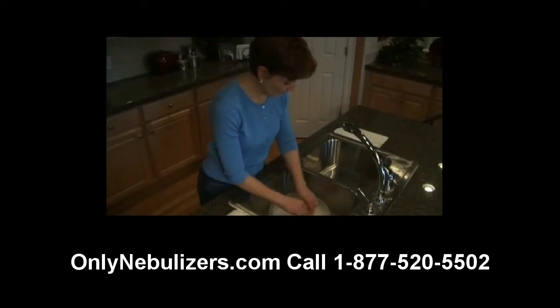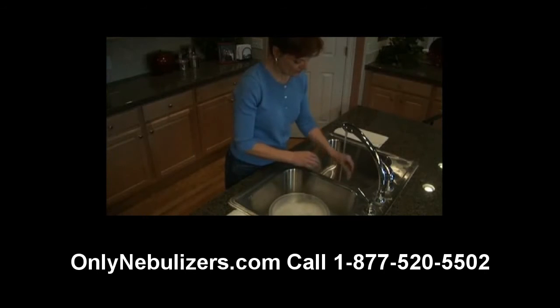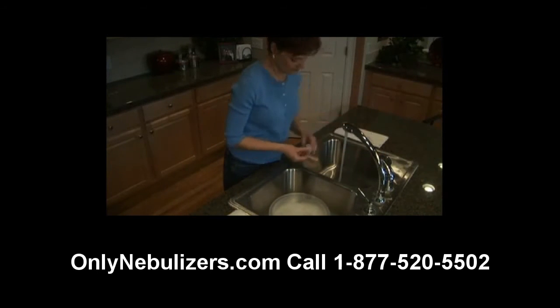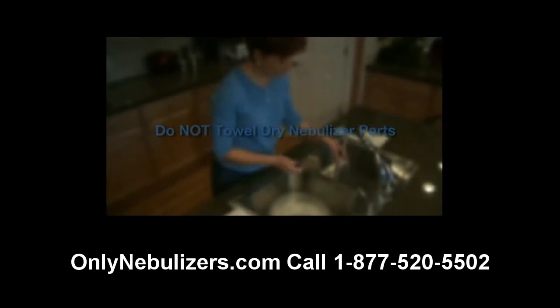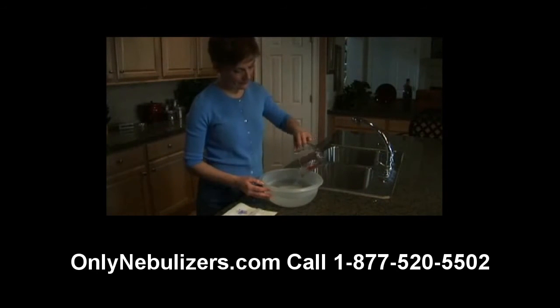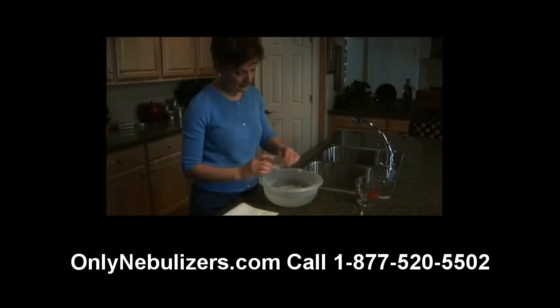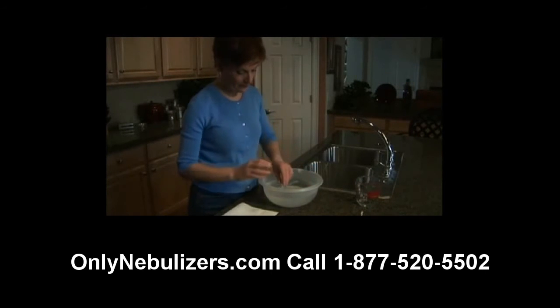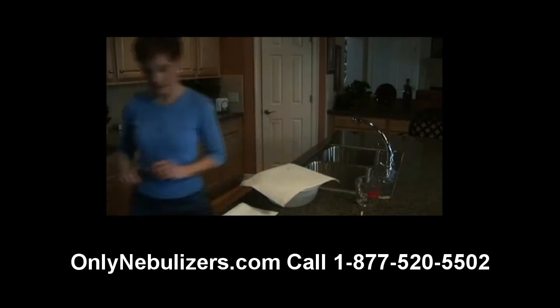Now you're ready to wash all parts, except the tubing, in a solution of hot water and dishwashing detergent. Then rinse all the pieces under hot tap water for 30 seconds and allow to air dry. Do not towel dry nebulizer parts to avoid the potential for contamination. On a daily basis, you'll also need to disinfect your nebulizer. This is accomplished by soaking your disassembled nebulizer in a clean container or bowl containing 3 parts hot water and 1 part white vinegar for 30 minutes, or you can use a medical bacterial germicidal disinfectant available through your medical provider.